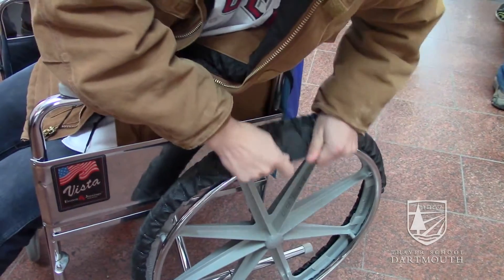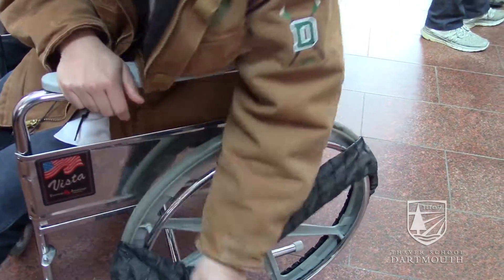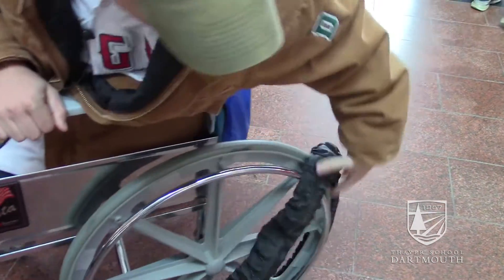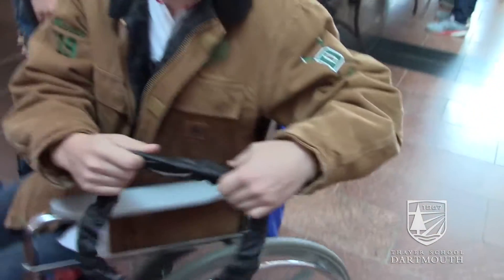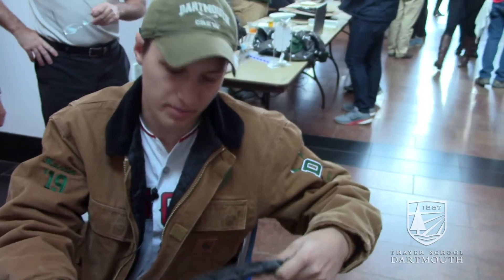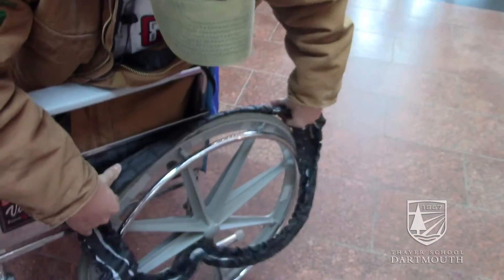And then if you want to just take it off, you just roll. And then the ease of use is putting it back on. It's convenient and easy.